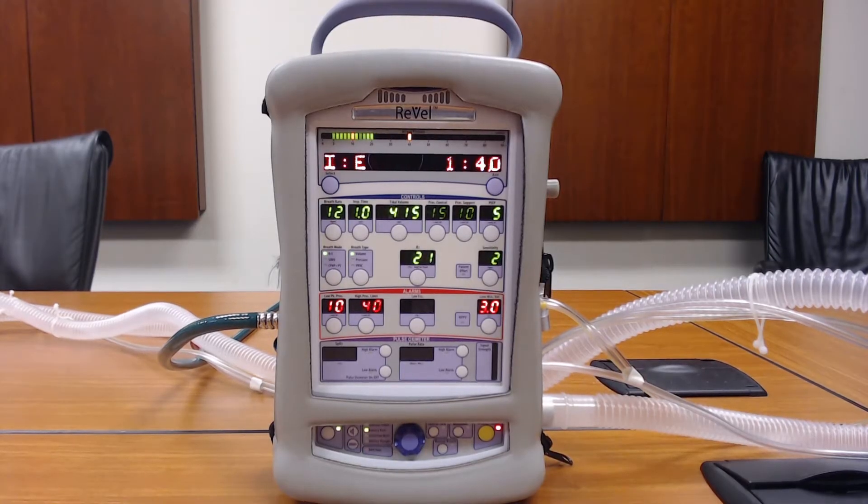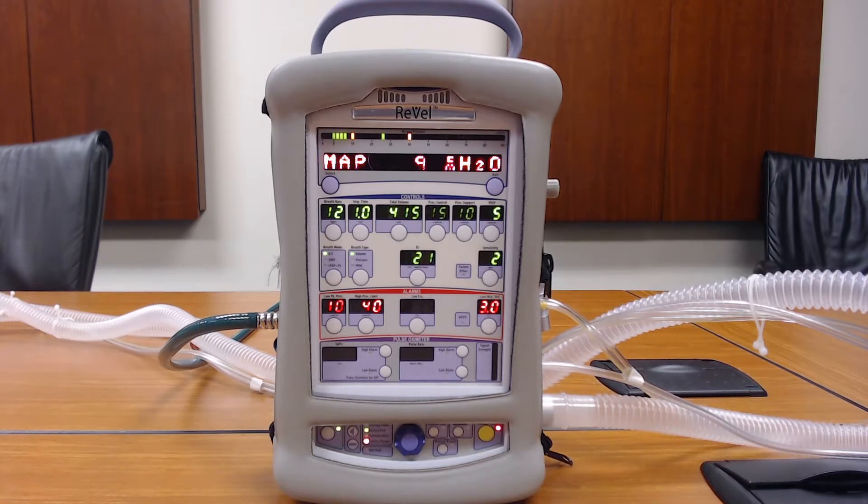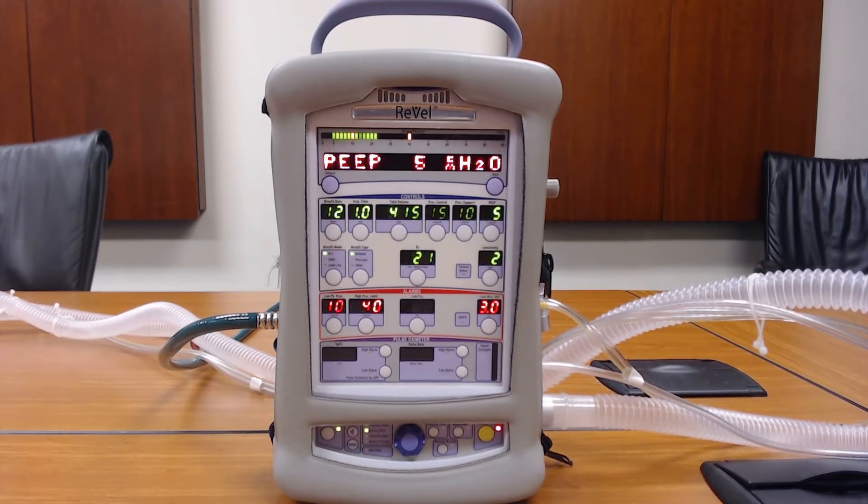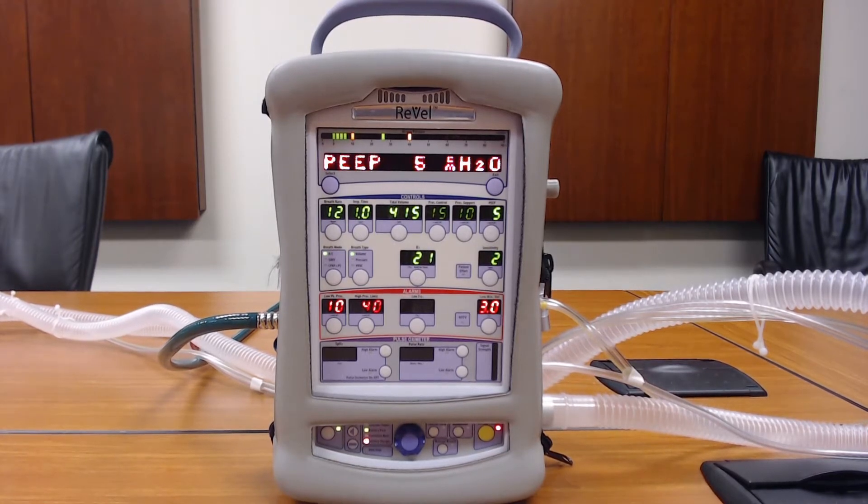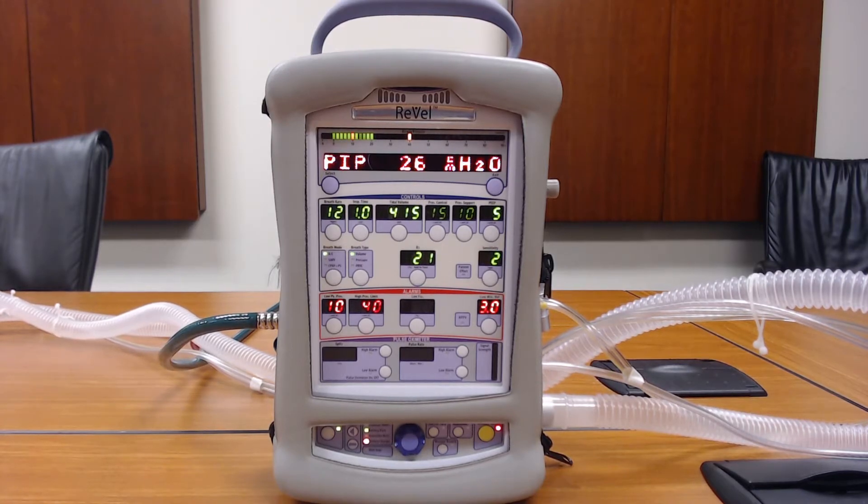Hello and welcome to another video on the CareFusion Revel ventilator. Today we're going to go over how to access the extended menus within the Revel ventilator.